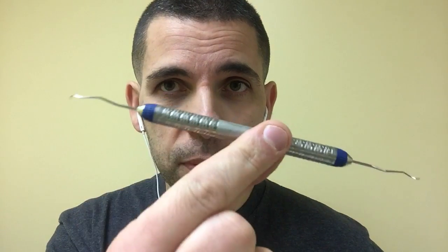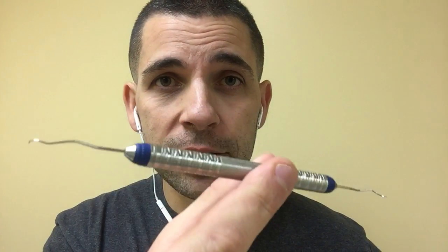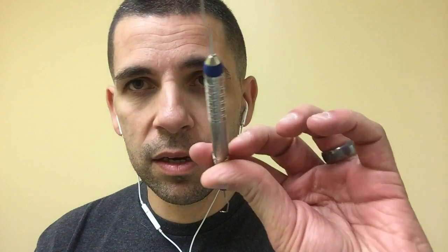Here are seven ways to help you detect calculus. The first one is the old school Perio Explorer. We all had these in hygiene school and a lot of us, including myself, gave up on it. I didn't come back to it until a year or two after hygiene school. This is probably the best way to detect calculus blindly. If you don't have this and you're not using it, I highly recommend you get them back. I still have mine from school — they're really good.